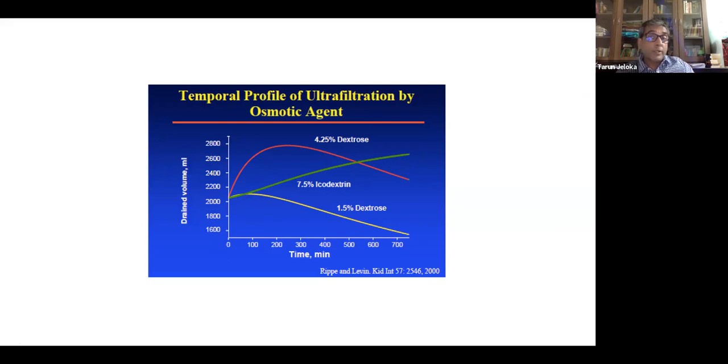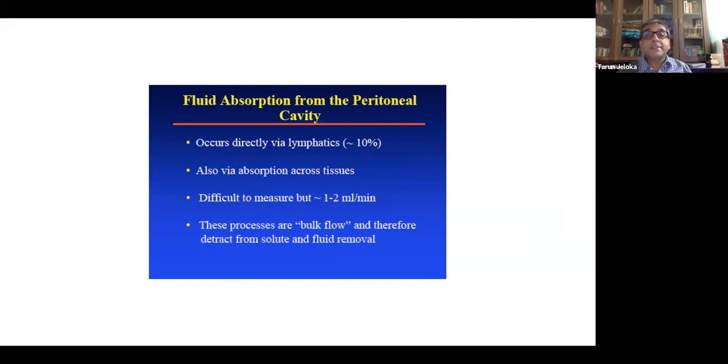This is very important. So sometimes the question is asked, if a patient presents in fluid overload and there is no access and you want to continue with peritoneal dialysis, how will you manage? Never say icodextrin, because there you will require small, frequent, high concentration glucose bags to result in maximum ultrafiltration, right? So that was the clinical part.